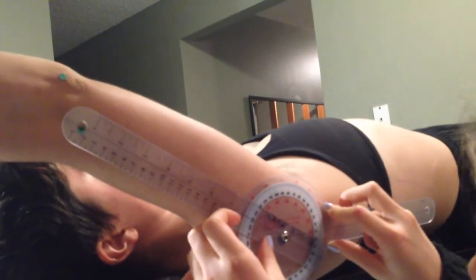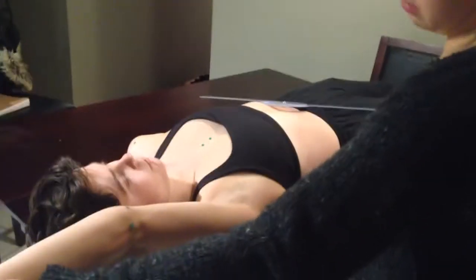This is 150. I'm just going to take you through passive now.